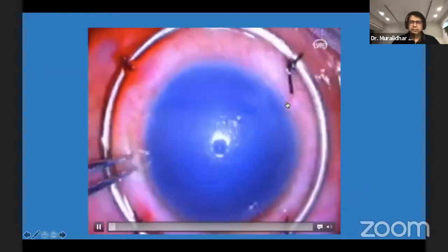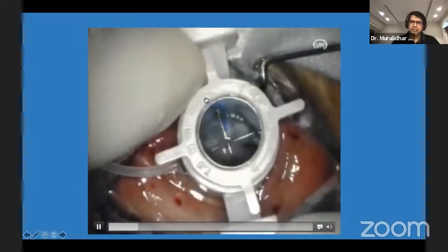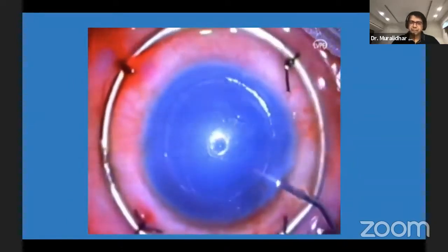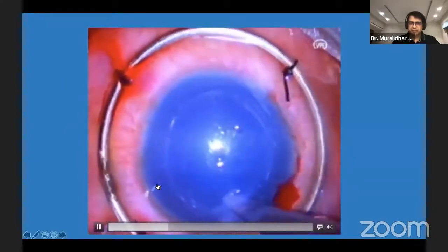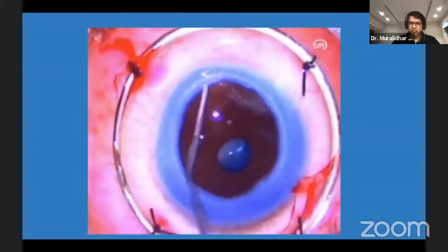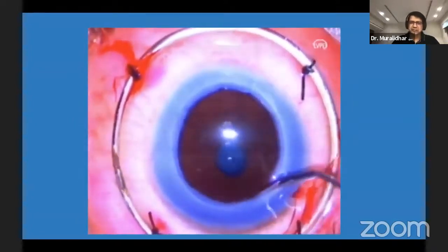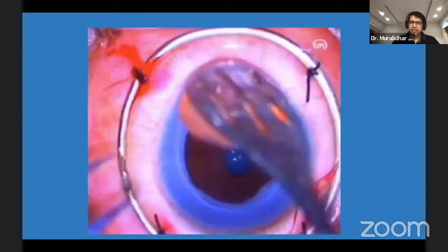This particular video highlights the importance of the Flieringa ring. Make sure the Flieringa ring is about 2 to 3 millimeter bigger, so it helps you avoid some inadvertent complications intraoperatively. Again, as I said, the vacuum trephines help you be much more accurate. You can consistently achieve 90% depth. These are some of my old videos. It's a while since I made a presentation on penetrating keratoplasty, and I was keeping a very thin, uniform ledge all around.